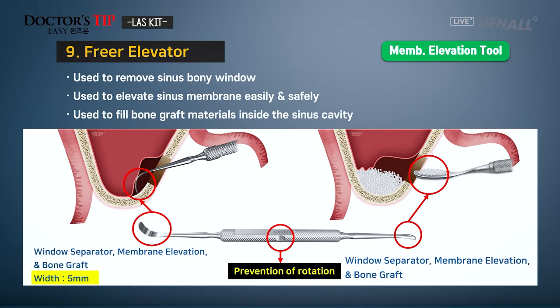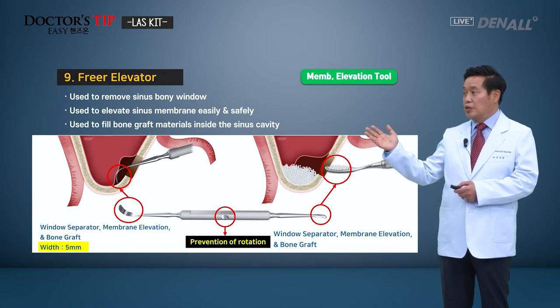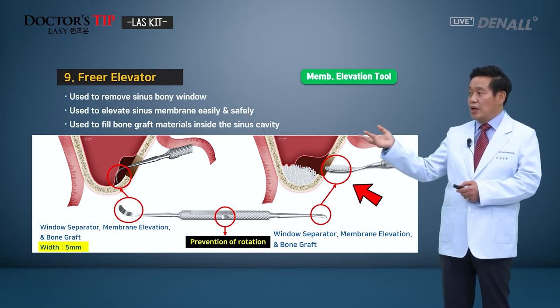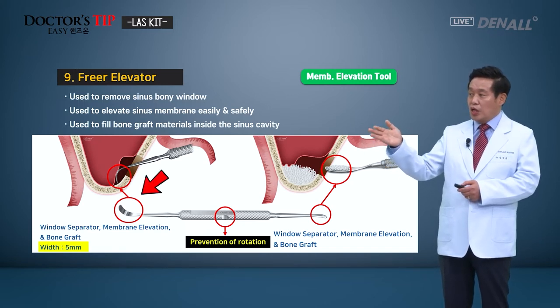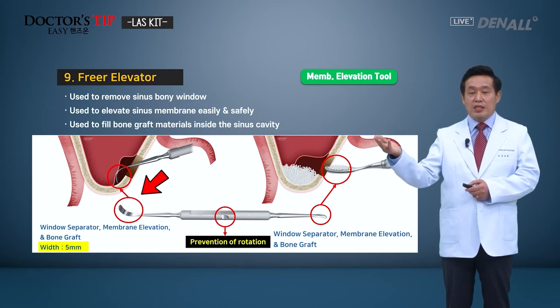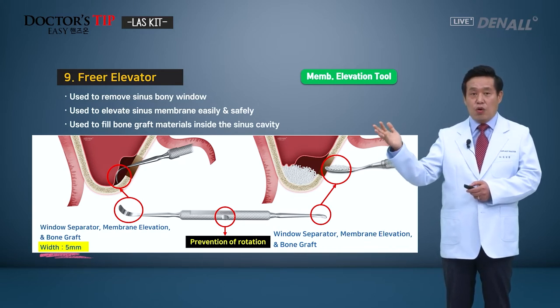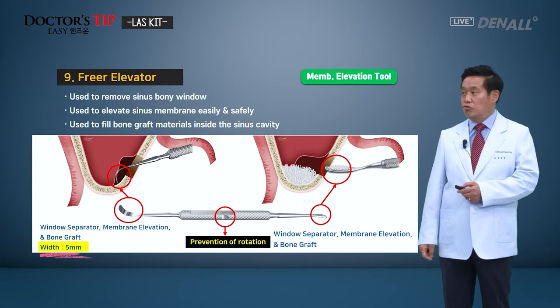Next is the freer elevator. It's the instrument that I use most frequently, and a lot of procedures can be performed with it. On one side, it can be used to separate the lateral window or to elevate the sinus membrane, and it can also be used for bone grafting. On the other side, the bended part is for sinus membrane elevation. The freer elevator tip width is 5 millimeters, so it's a bit on the wide side. Using this very safely, you can elevate the sinus membrane.